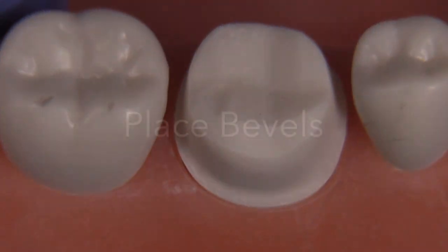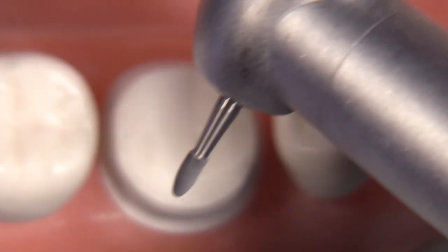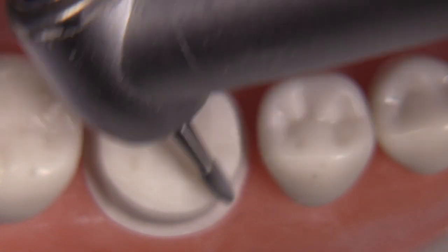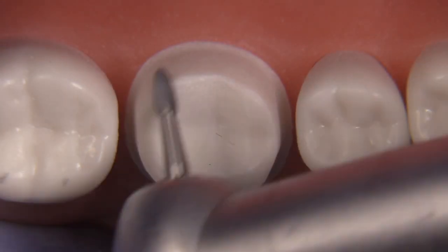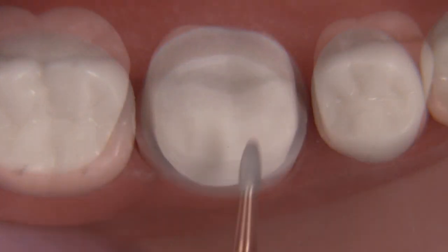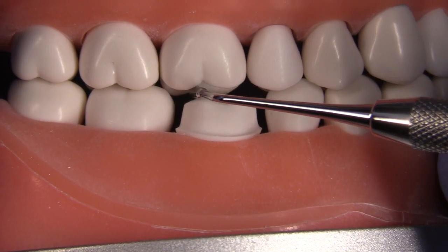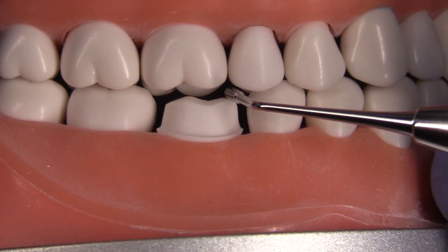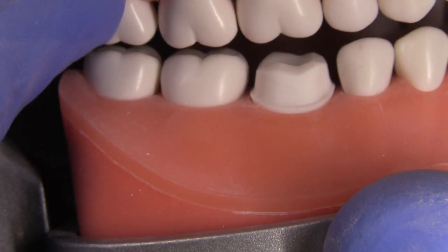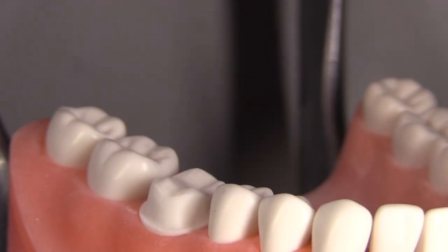Things are moving along well. Let's place some bevels between the occlusal and axial walls. For this we can use a carbide like a 7404, a 7102, or even the KS0F we were just using. The key is you don't want any sharp edges between the occlusal and the axial that might impede the lab work and fabrication of the coping — any sharp edges could complicate the laboratory work. The preparation is pretty close to being done. Let's check clearance with the RGS4 — it's 1.5 millimeters and it fits easily with a little bit of wiggle; that's what you really want to see, with the typodont fully closed. You can go through excursives to make sure there are no unseen areas that need to be reduced.